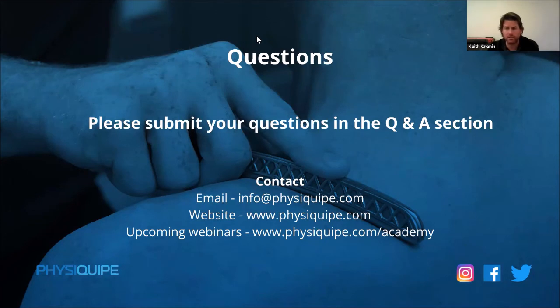You could use it 3-4 times a day. Most of the time the benefits last about 2 to 4 hours, so you'll get continued pain control for 2 to 4 hours. Just note that eventually, like anything mechanical, your body does return to a steady state. That's why you have to make sure you're using it for pain control, but you're doing your exercises, controlling the load, using the soft tissue stuff, because then eventually the VibraCool part goes away because you don't need it.